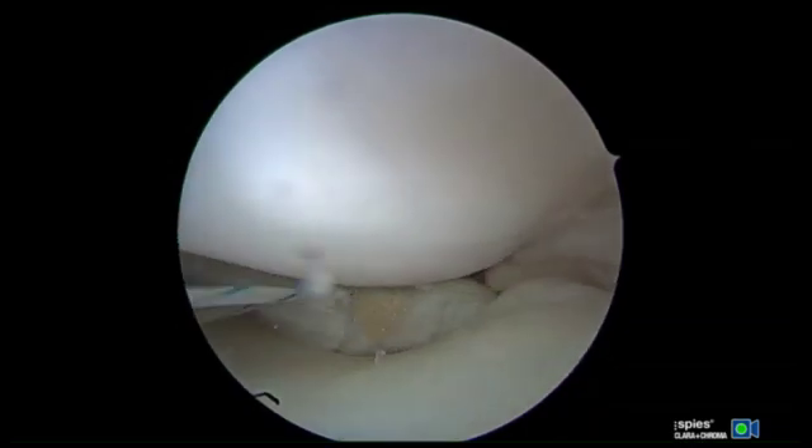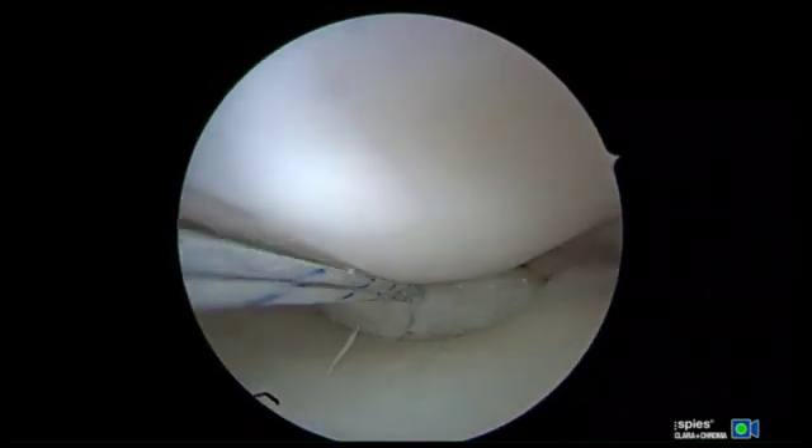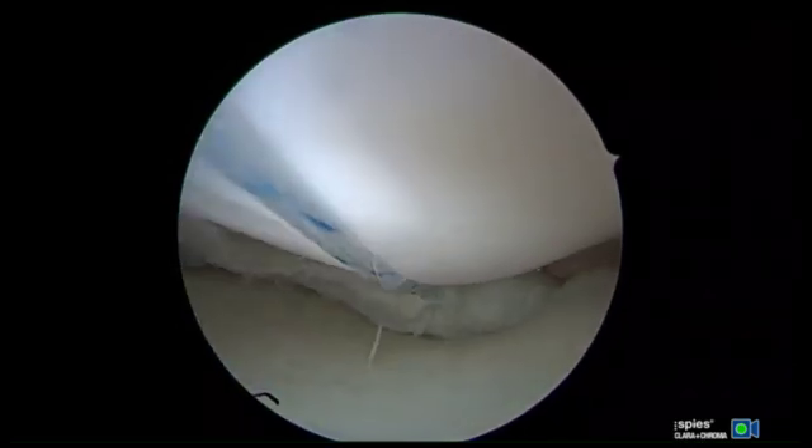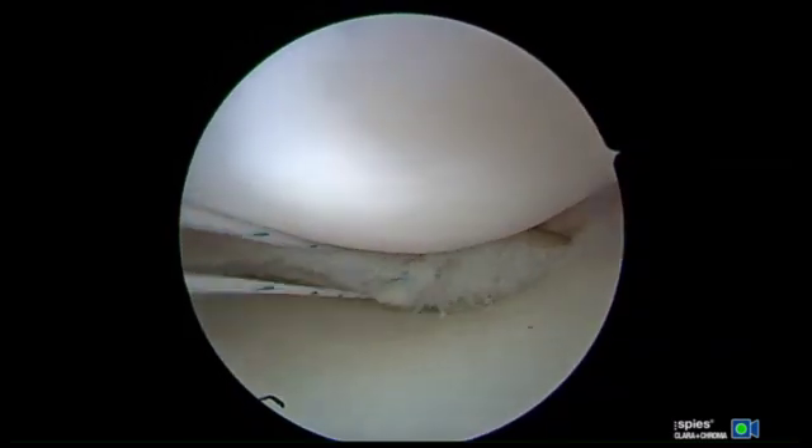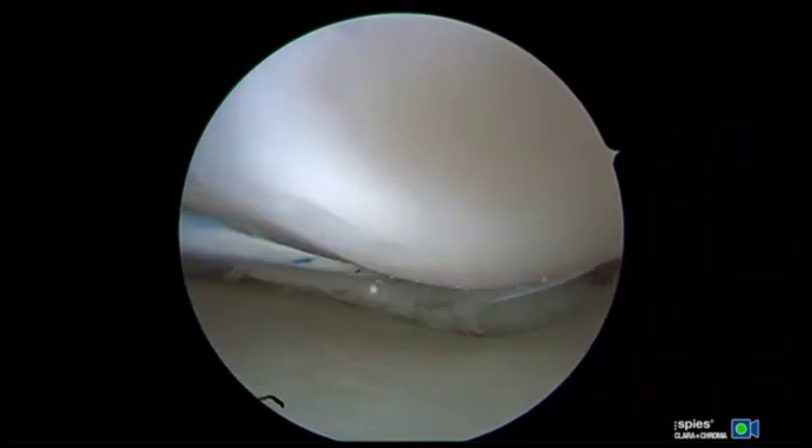The strands should then be firmly pulled to ensure there is adequate purchase to the meniscus, and the suture should be tied and cut arthroscopically. A subsequent stitch is placed 3-4 mm adjacent to the prior stitch. Ideally, an arthroscopic probe should not be able to fit in the space between the two sutures.